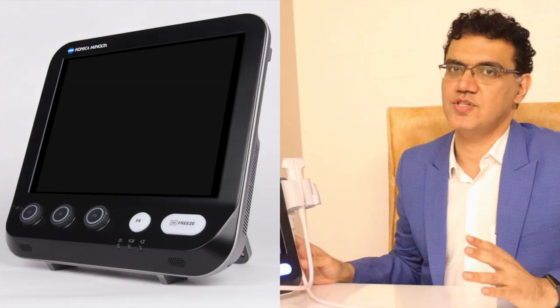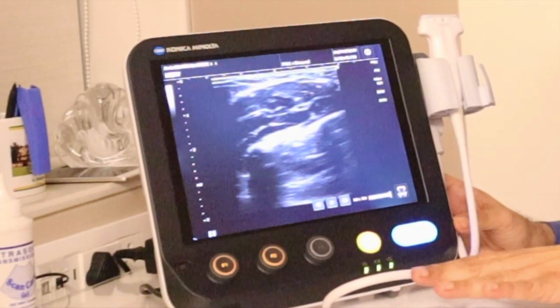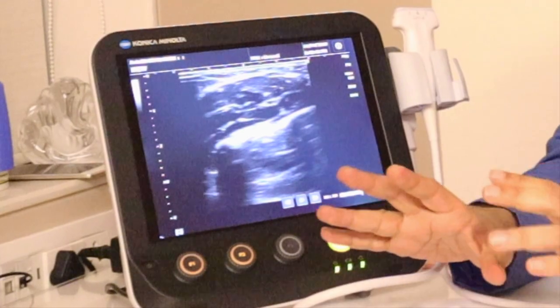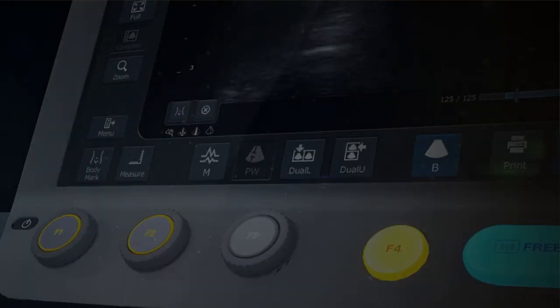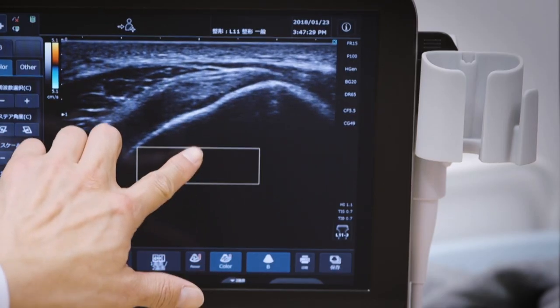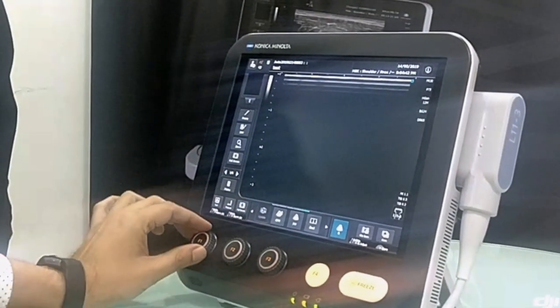The MX-1 is a really great product. The moment you see it, you're struck by it. Why? Because there's actually no keyboard here. This is in fact the only machine that you can find that has no keyboard. It's just a keypad that's built into the screen. What you see here is a complete touchscreen — it works entirely on the touchscreen — and all we have is just three clear buttons with a fourth F4 and a freeze button. The three buttons are for focus, depth, and gain, and you can use the freeze mode right here or even on the screen. Basically this is for people who are used to iPads and touch phones, where you can do your entire operations clearly from the touchscreen.